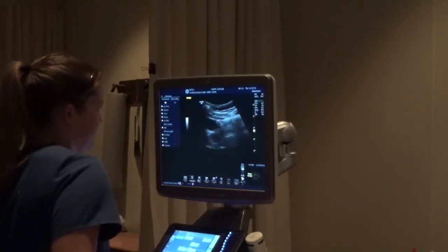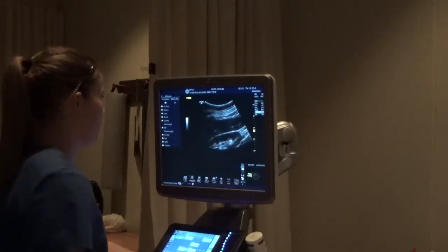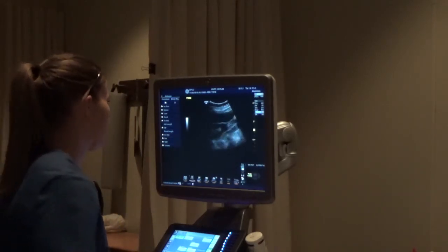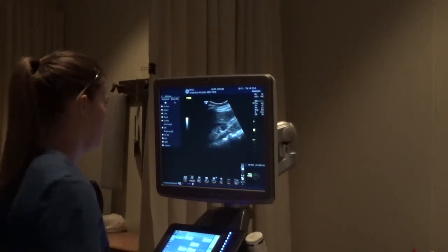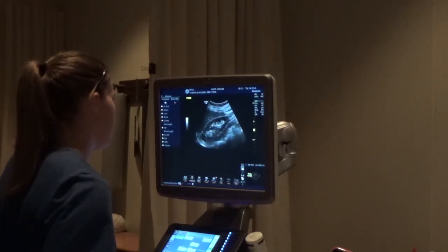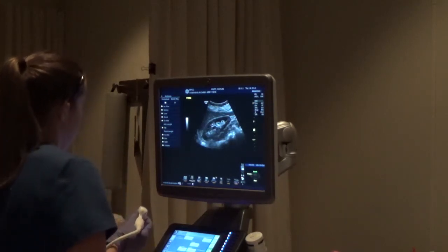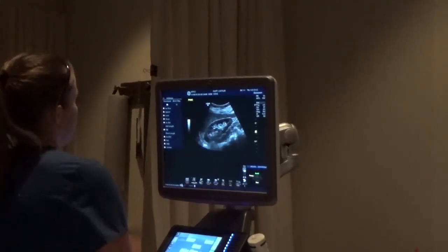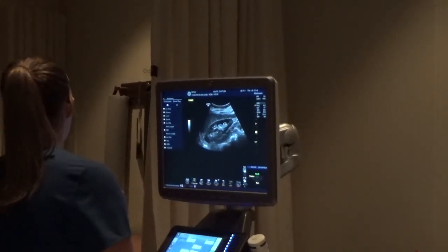All right, let's go over to the kidney. So show me a longitudinal image of the kidney, either one. Alright, big breath in. Okay. And then let's say somebody has a DVT that goes up into, this is just bonus, DVT goes all the way up into the iliac vein.